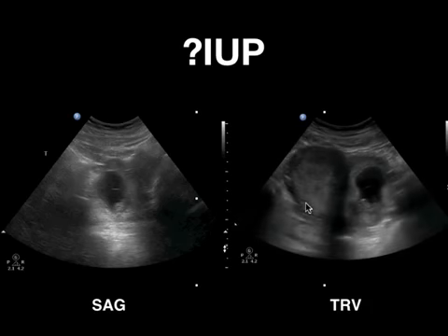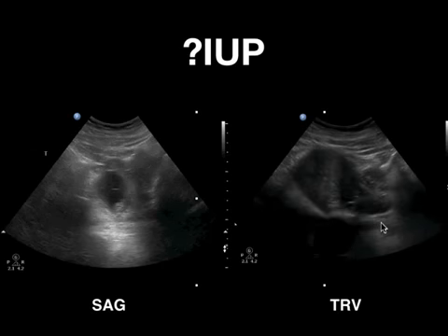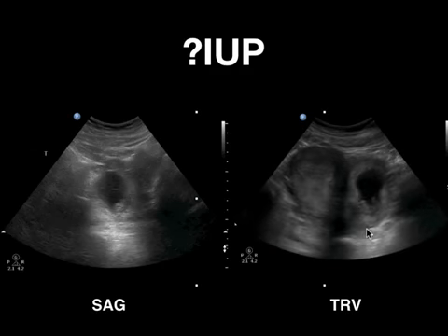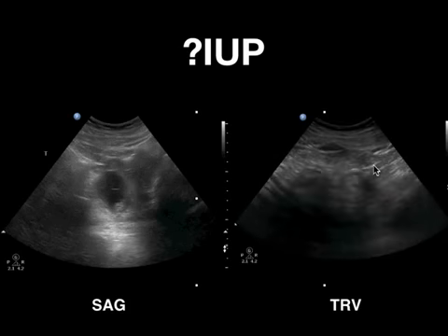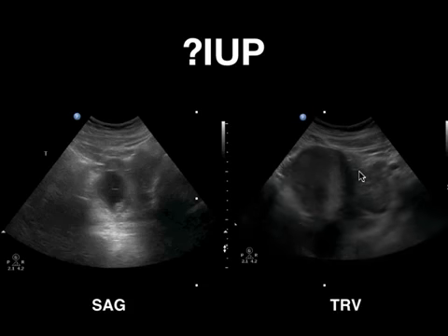And you can see on this sweep, here you've got uterus, here's pregnancy, but is this the right horn and this the left horn of a patient with a bicornuate uterus? If you take a close look here, there's no myometrium bordering this pregnancy. There's no border here at all. So that would go against this being an intrauterine pregnancy. This was a patient who had an ectopic pregnancy.